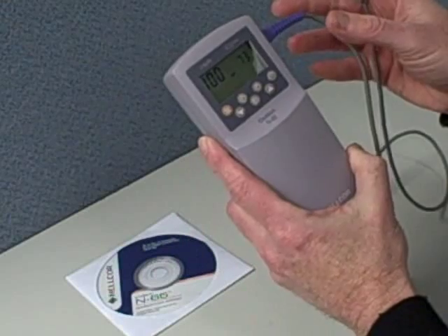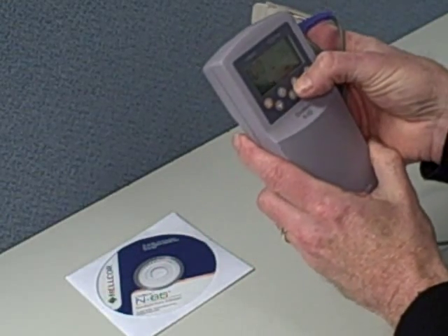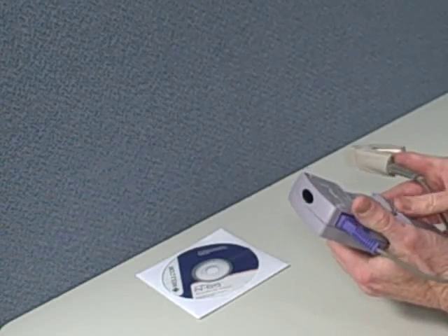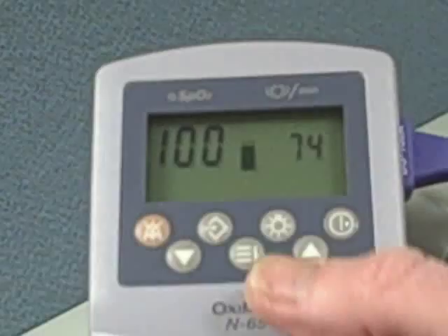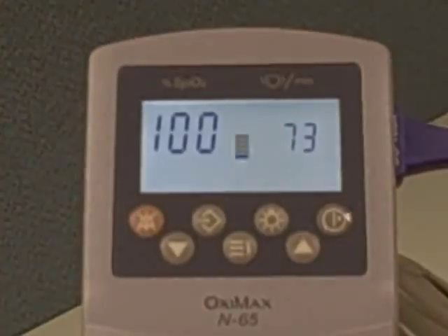Today we are looking at the Nelcor N65 handheld pulse oximeter with adult finger clip sensor, easy push button on and off, four AA batteries in the back, and a nice bright display with audible beep alarm as well as visual alarms.